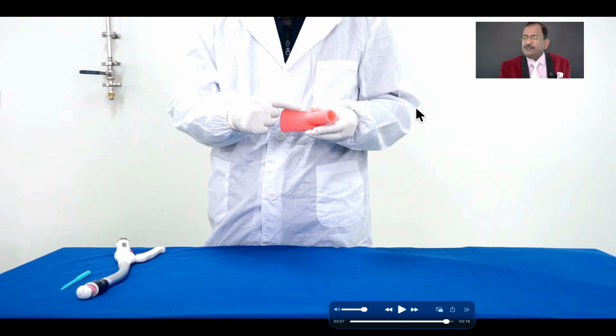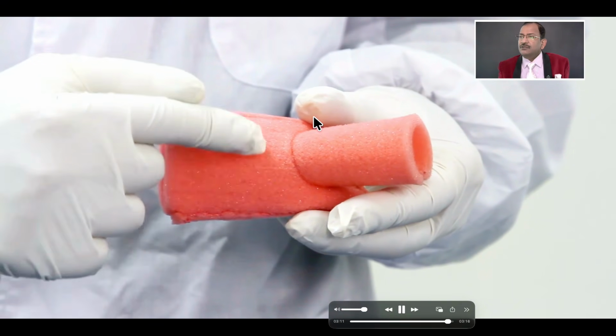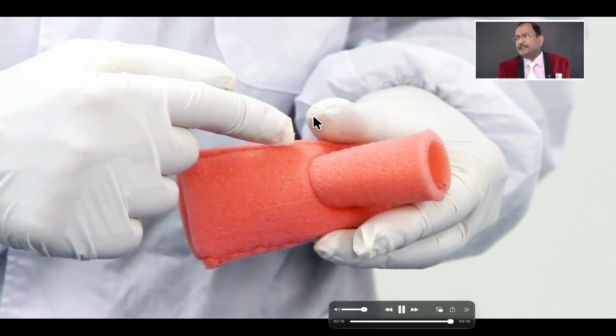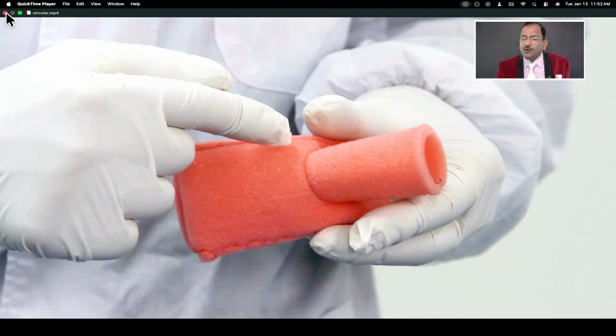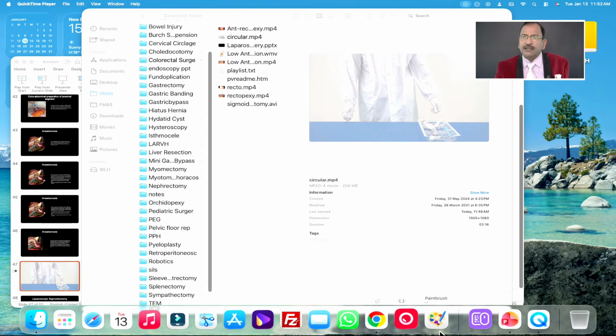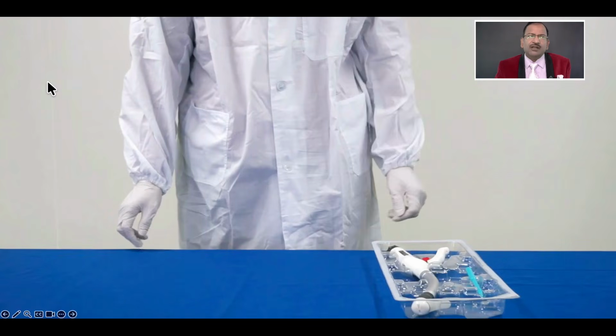Flat tire test means you will put some saline, fill up the pelvis, and through the anus you will put some CO2. And you will see that there should not be bubbles. So that is called the flat tire test. And the anastomotic line should be inspected. Nowadays, even in open surgery, open colorectal also, anastomosis is done by circular stapler. Nobody is doing hand-sewn anastomosis. It is not practiced.